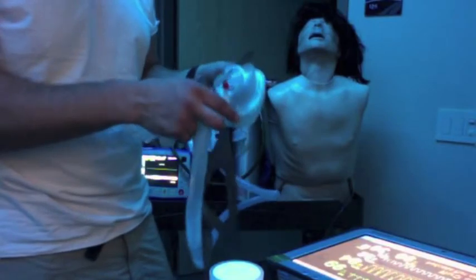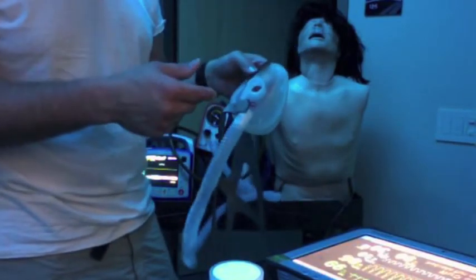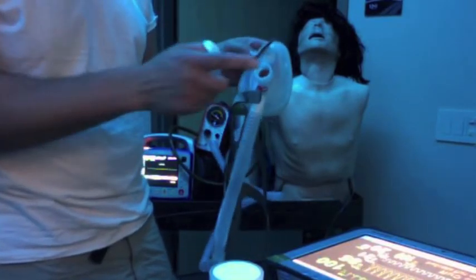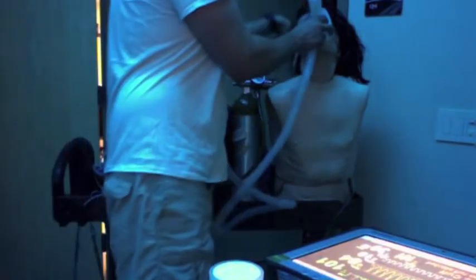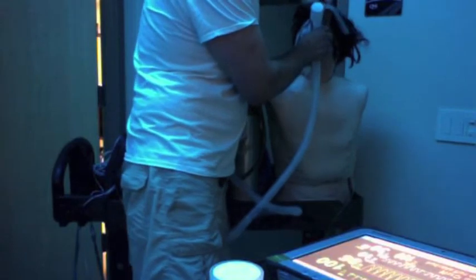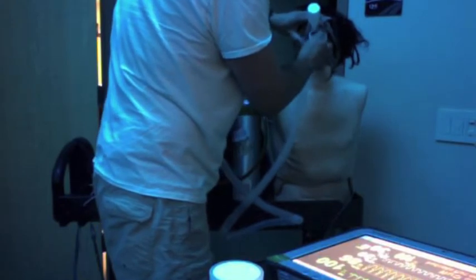Okay, putting these masks on is not always the easiest thing. I recommend putting one side of the straps on first. If you are going to put the mask on the patient and not turn the CPAP on right away, you need to take out the exhalation valve so they have a port to breathe. Otherwise, what usually happens is you put your kit together, you turn the machine on, and then place the mask on the patient, creating a nice tight seal. And remember, they will be taking in the air at this time. You definitely need to coach them through this, tell them what's going on, calm them down. A lot of times they'll be anxious.